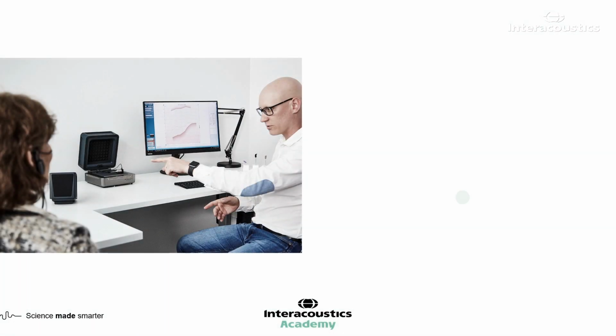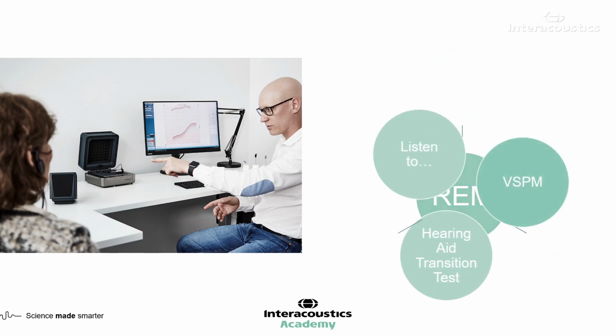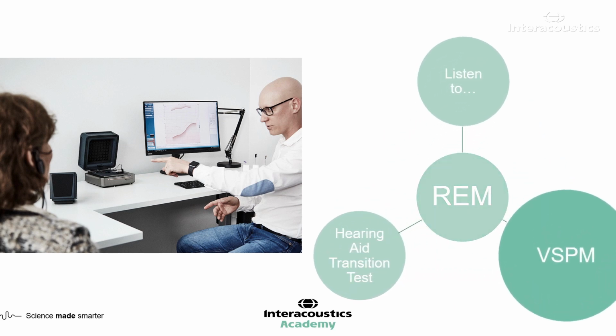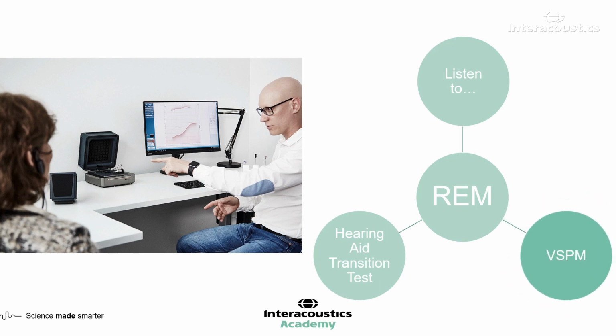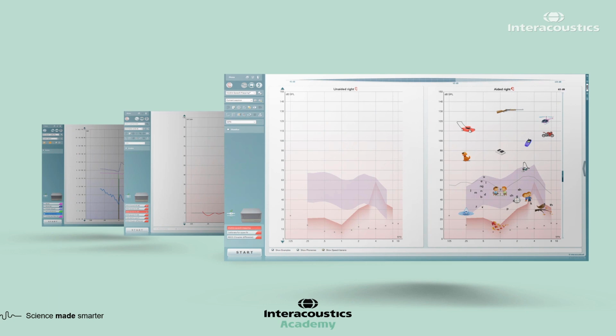REM is one method of personalizing the hearing aid programming for the individual, but it has far greater reach beyond the hearing aid output. REM and its extensions are tools that can effectively engage the client in the fitting process, as well as their significant others. Visible speech mapping, in conjunction with REM, provides a multisensory approach to counselling. I would refer you to some of the other Academy webinars and videos about visible speech mapping for a more in-depth look at the tool and how it can be used.